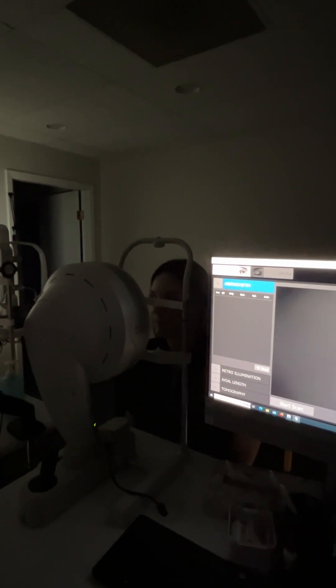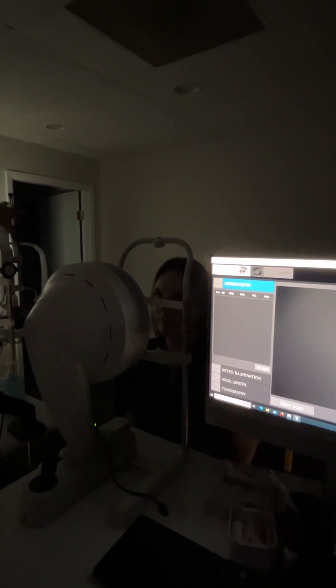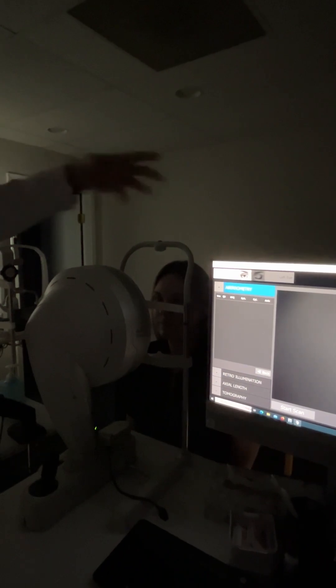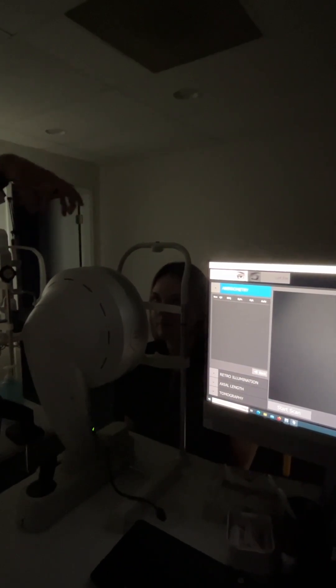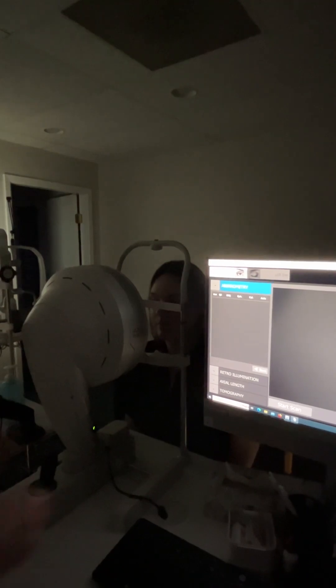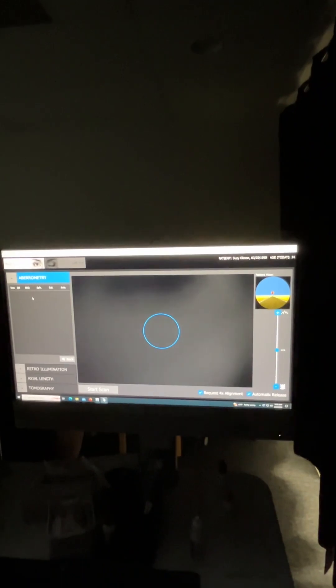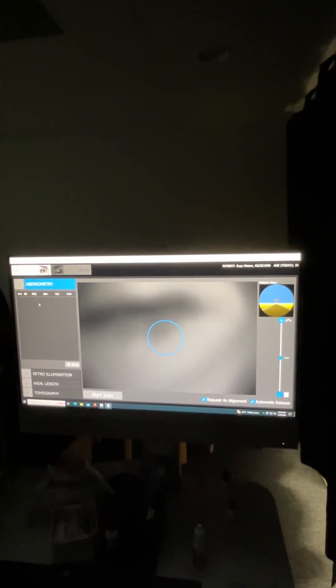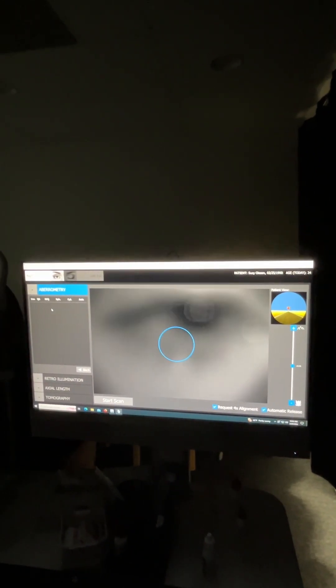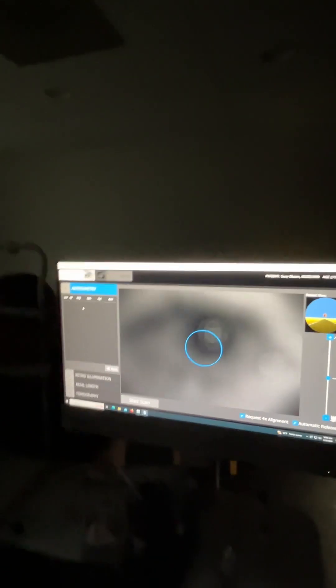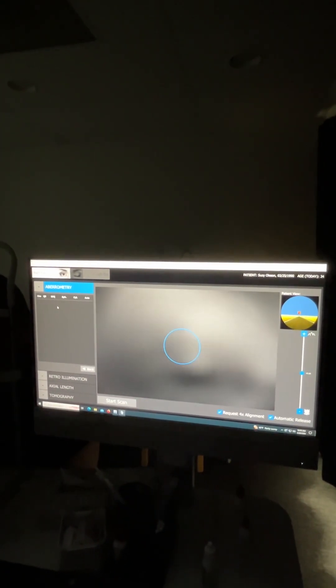That is probably okay over here, but again, if you had like a computer in the background whose maybe monitors facing, that will give you erroneous data. So we've already taken care of that. So we're going to get started over here on the right eye. Susie, rest your chin there. Like all instruments, you can just raise and lower the table. You feel pretty good there?